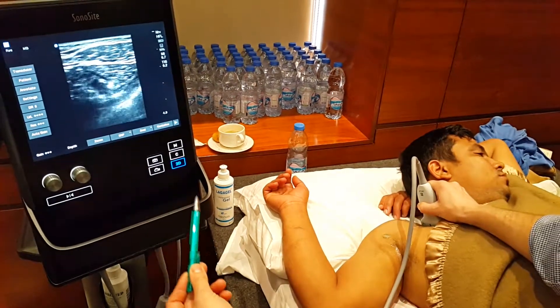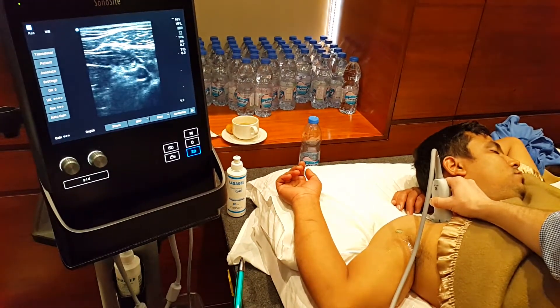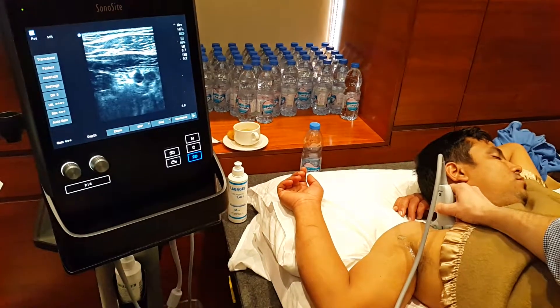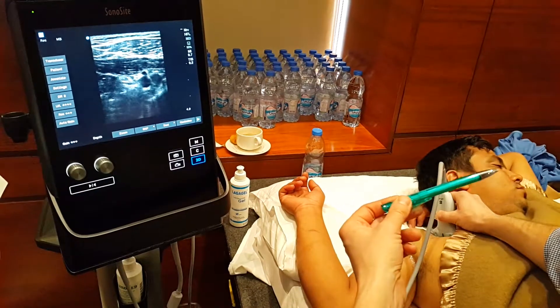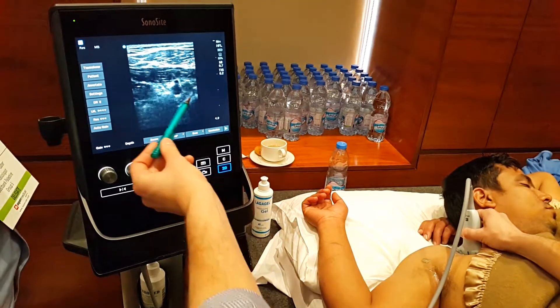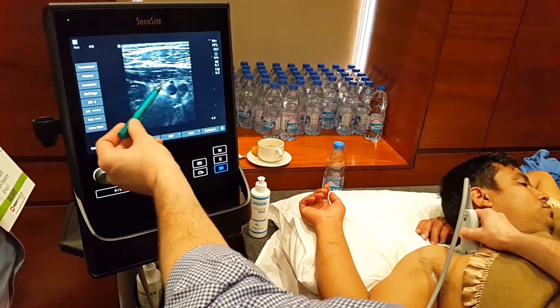So I want to be a little bit more lateral. And here we can see the cords — these are the cords of the brachial plexus. So if we're doing an interscalene, we've got the roots and the trunks, and then we get the divisions behind the clavicle, and then we get the cords of the brachial plexus. At this level, they're lying all together — three cords lying all together.